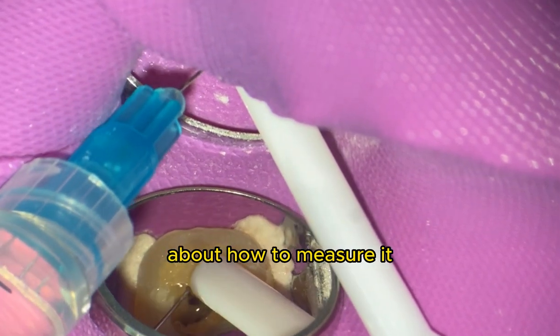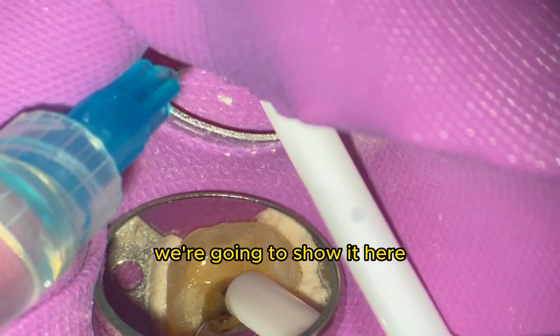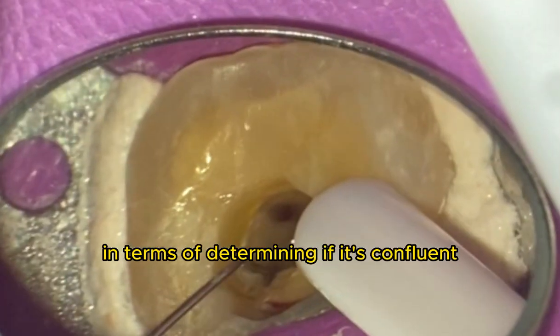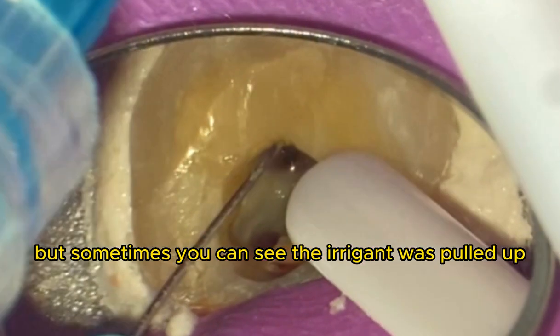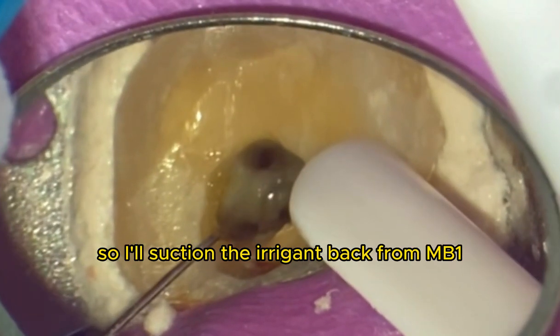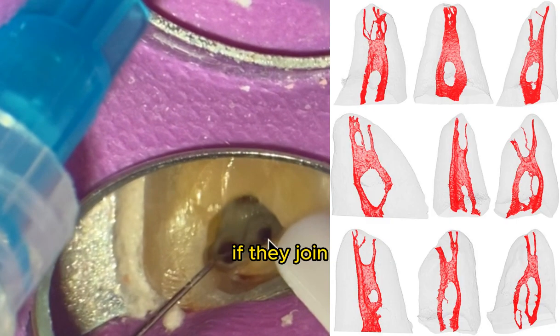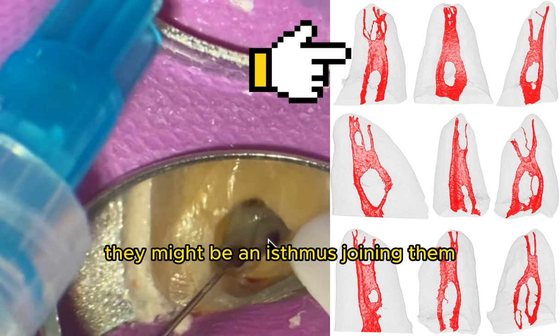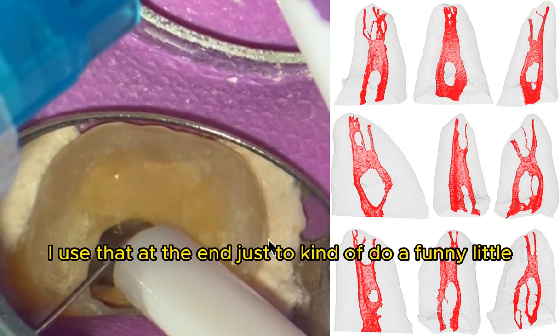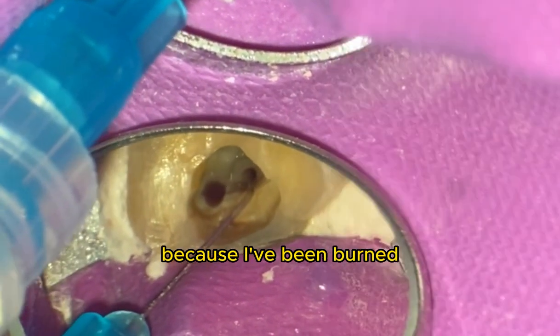You can also do the aspiration test — we'll show it here. It's not 100%; I've been burned by this before in terms of determining if canals are confluent. But sometimes you can see the irrigant being pulled up: I'll suction irrigant back from MB1 and you'll see it come up through MB2. Sometimes if the canals join via an isthmus but their apices are separate, I use that aspiration result at the end just as a feel-good check — but don't rely on it entirely.